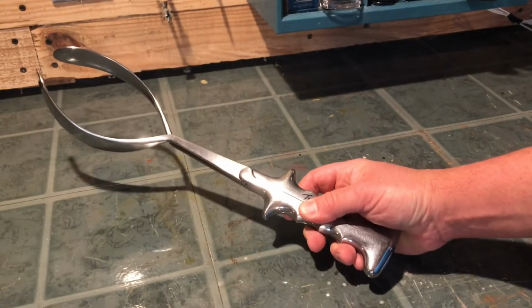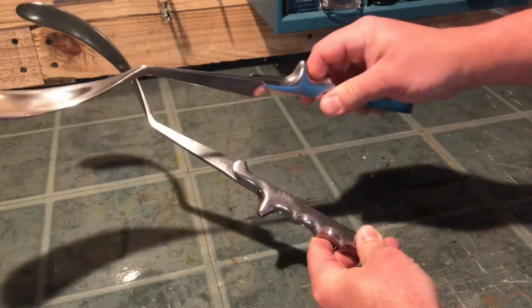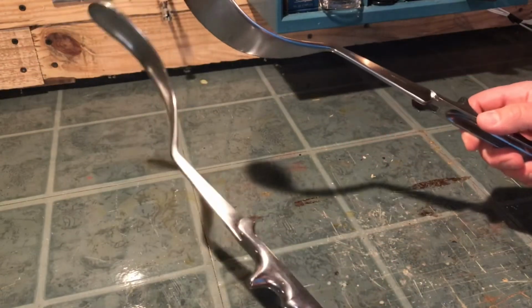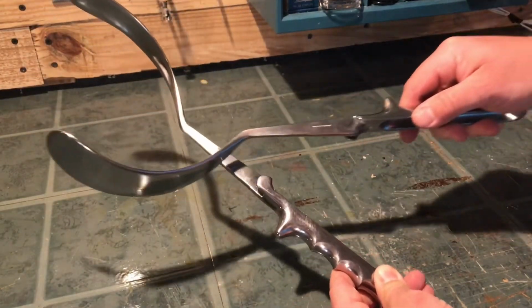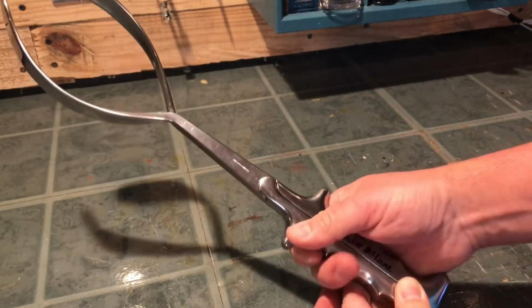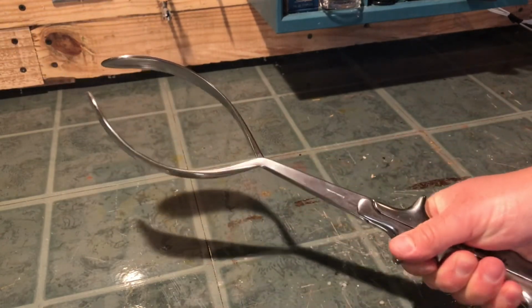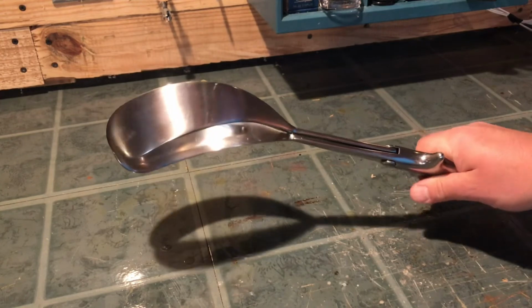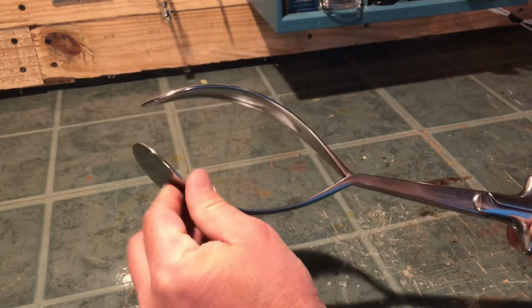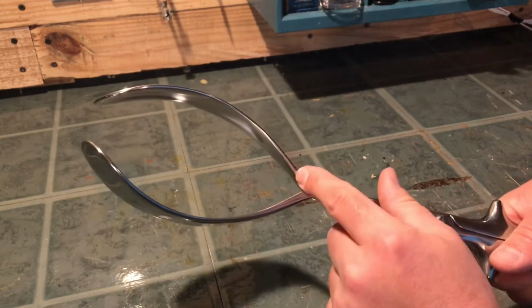Now here I'll just show you how the instrument latches together, or fits together. It's just two separate pieces. So one side would go in, other side would come in, and then they fit together at this hinge, creating the handle. And while these are called blades, they're not sharp, they're rounded. This would be referred to as the toe of the instrument, and this would be the heel.